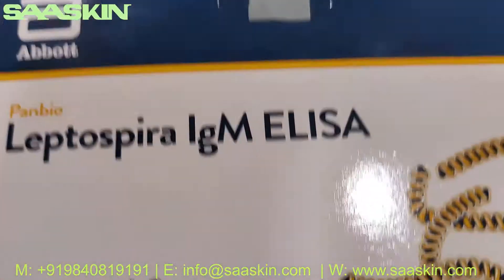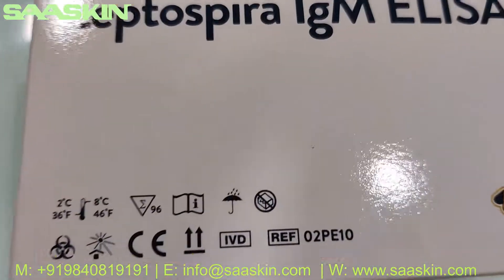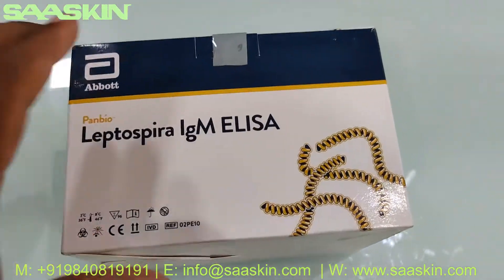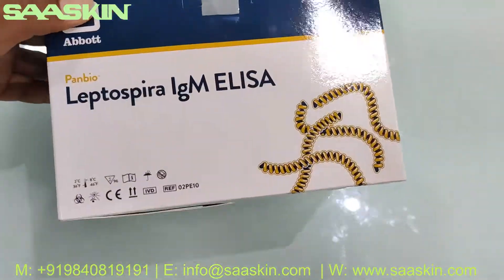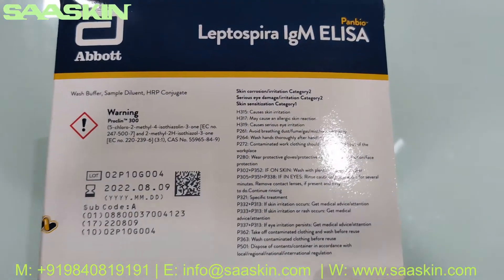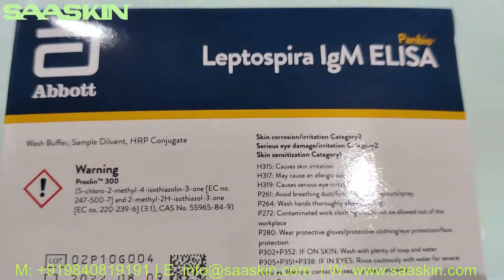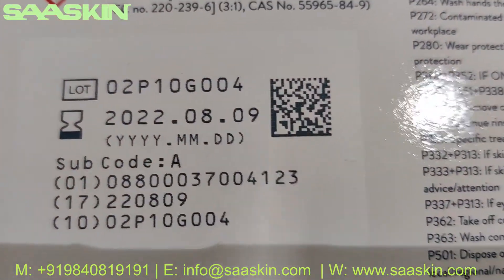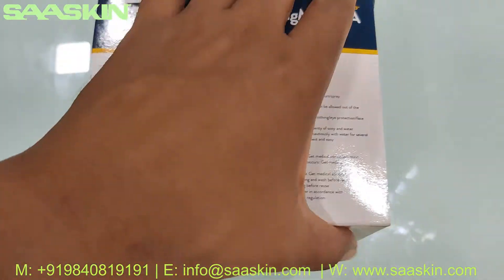You can see the part numbers. It should be maintained between 2°C to 8°C. Let me show you the complete box — this is the top view and this is the front. On the other side, you can see the expiry date.